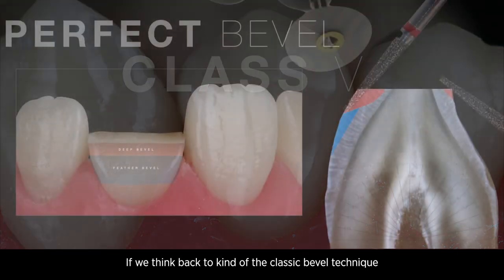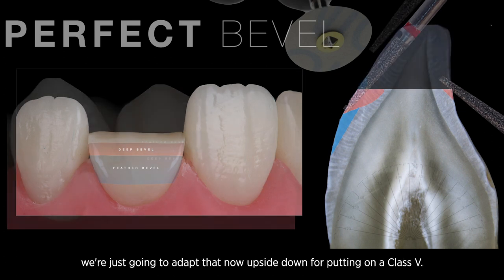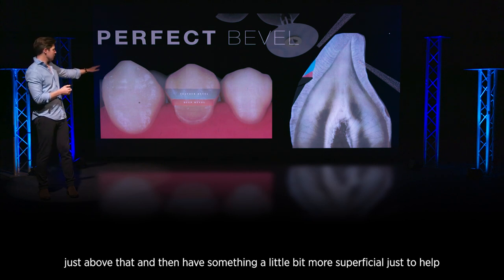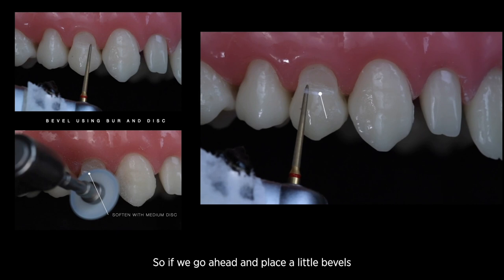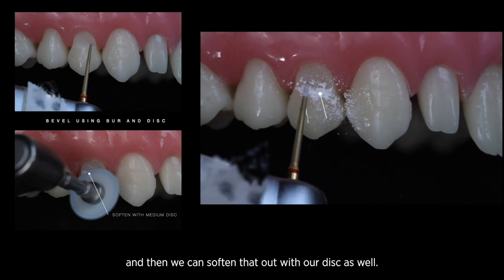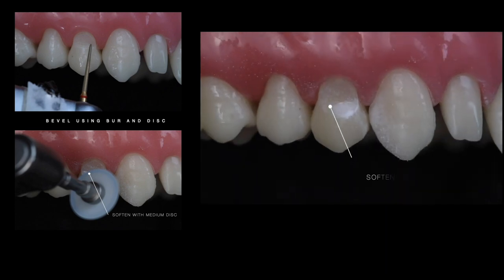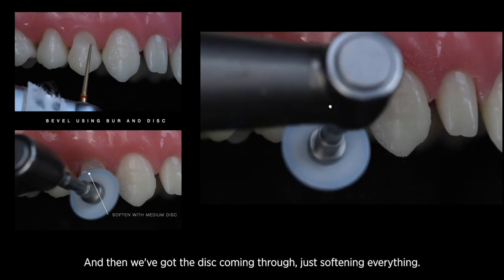If we think back to the classic bevel technique we use on our Class 4s, we're going to adapt that now upside down for our Class 5. That deep portion of the cavity — we want to create a deep bevel just above it, then something a little more superficial to help the optical transition into the natural tooth. We place our bevels gently, as Class 5s are a little more delicate, then soften that out with our disc to get that nice natural gradient coming through.